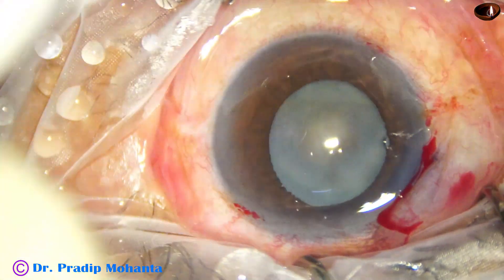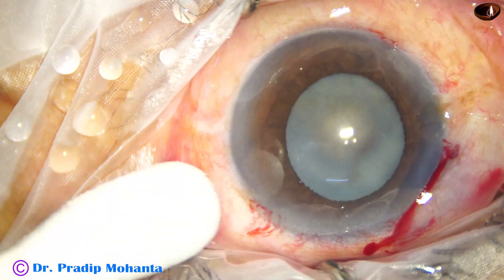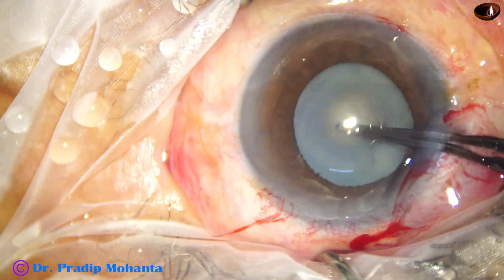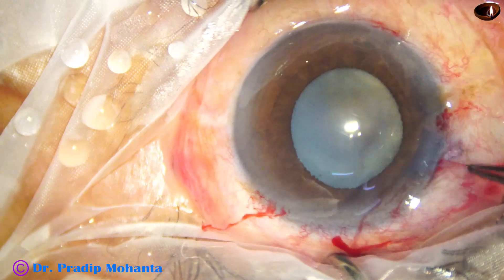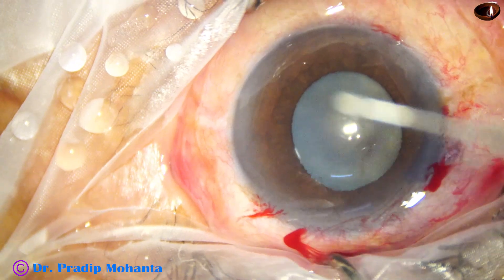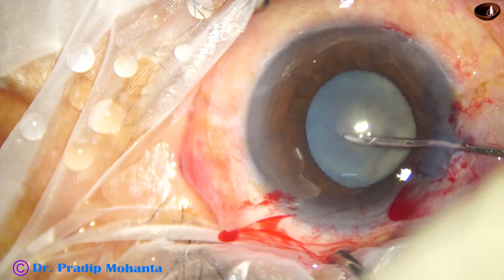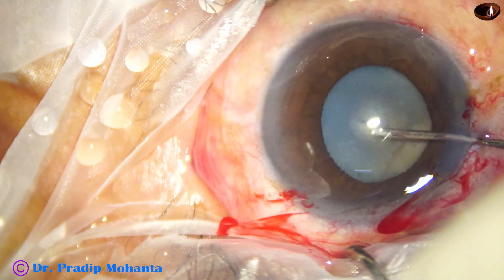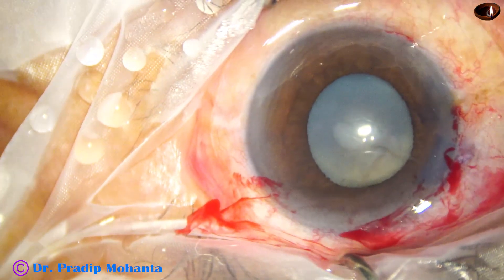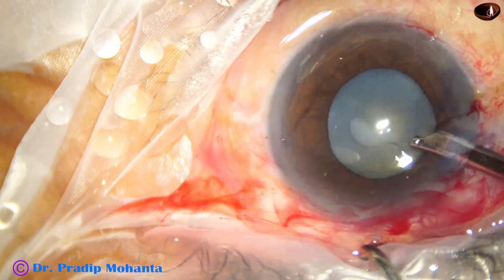And now capsulorhexis is to be done. I am going to use a needle to make a puncture on the anterior capsule. I used the utrata forceps, found that it is difficult to pierce the anterior capsule. And then I used a sharp needle, 26G.